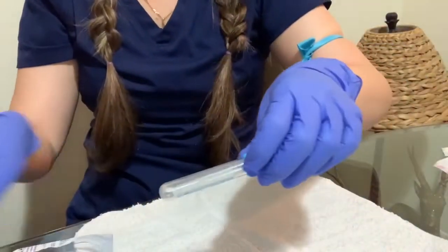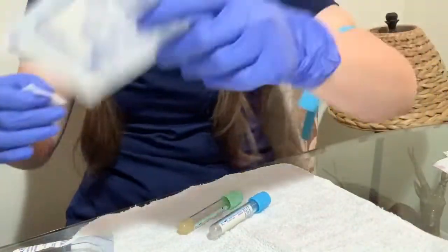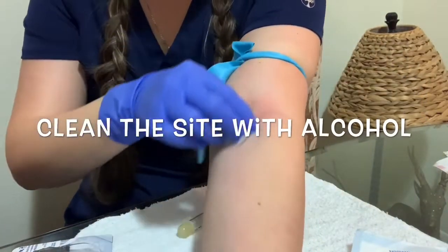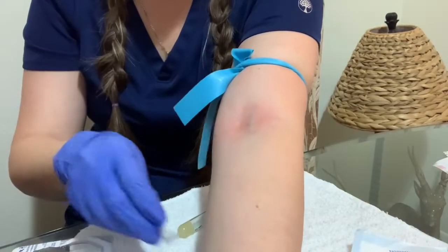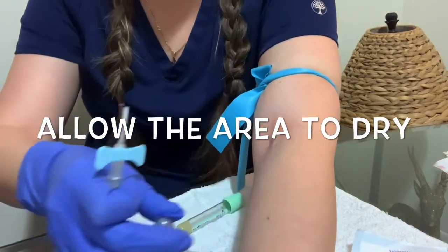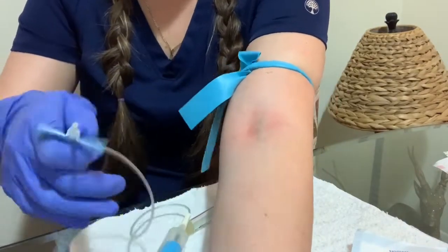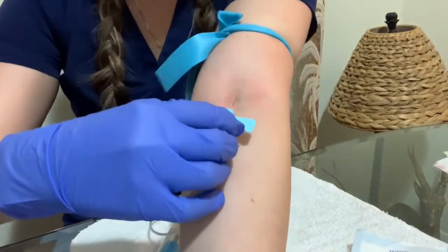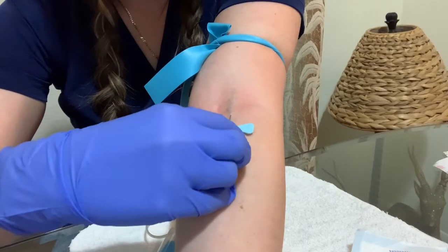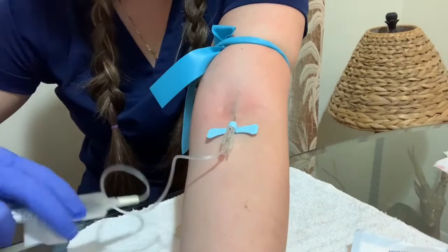Always get your supplies, check the order, and see what tubes you're gonna need — get the right tubes. Explain the procedure to your patient, wash your hands, put gloves on, and place the tourniquet. Clean with an alcohol swab and let it dry. Get ready after you find that vein — this side is a very good side to look for a vein.